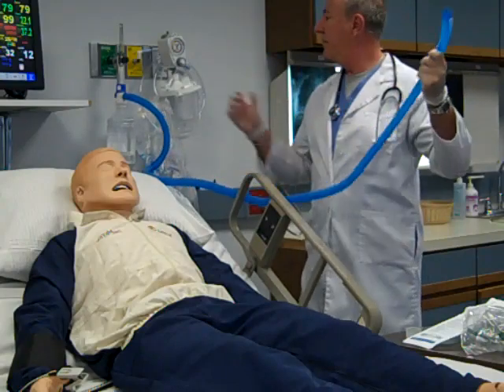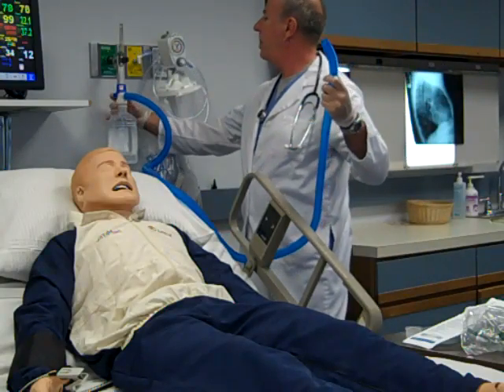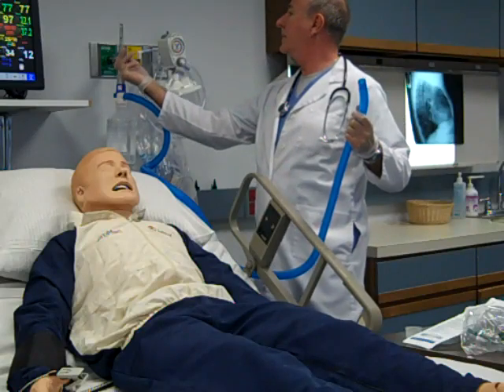Adjust the FIO2 of the neb head by turning the adjustable collar to the proper percentage. Turn the flow meter to 12 to 15 liters per minute.